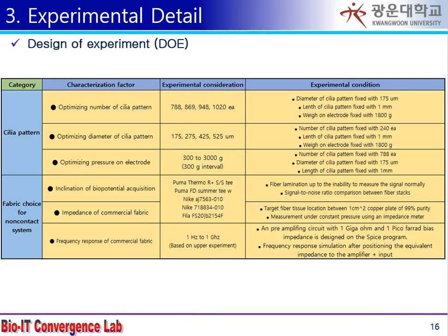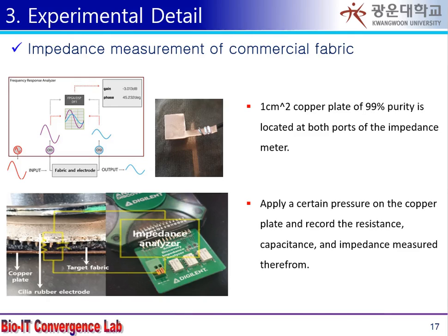The experiment consists of two parts: fiber optimization and electrode optimization. An experiment with an impedance analyzer was planned to select the optimal fiber.